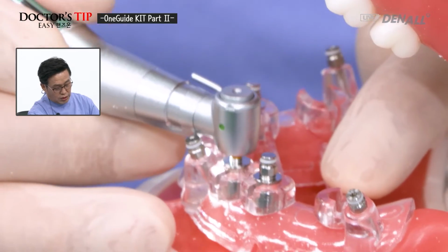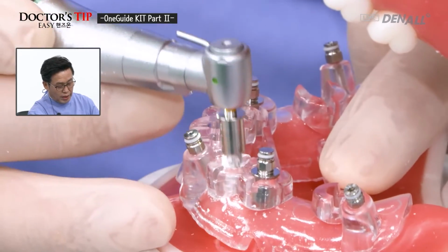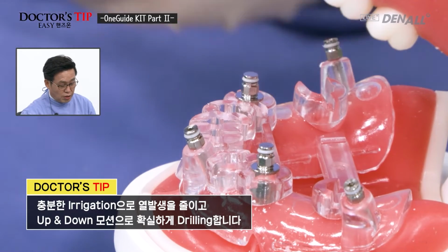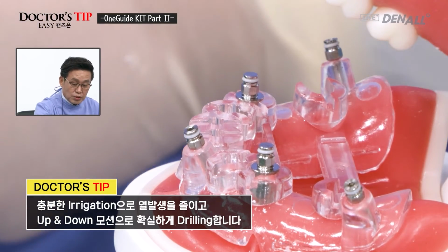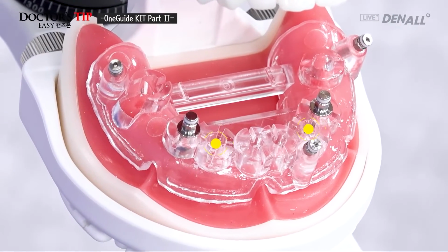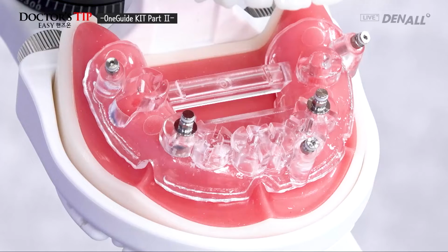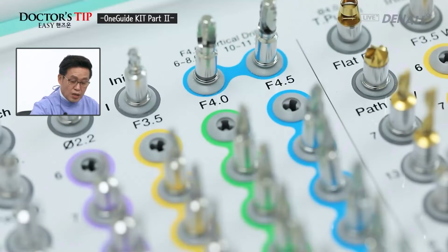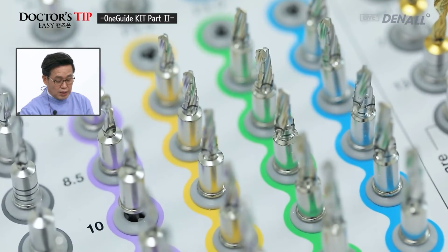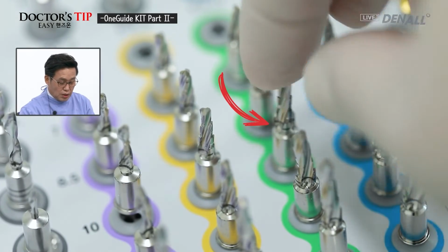This is the same for this canine as well. Full length drilling is done. I'm going to do up and down motion and do irrigation to minimize heat generation. On both canine sites, 4.0 by 10 millimeter is going to be placed. OneGuide drill 4.0 by 10 millimeter drill is chosen. This drill has been chosen.